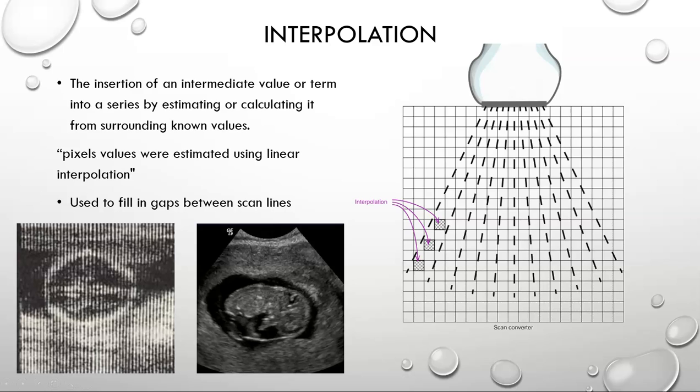You can see in these images the one on the left has no image interpolation, and the one on the right certainly is using image interpolation. It makes the picture much more gooder.